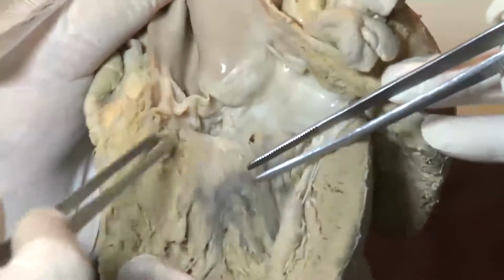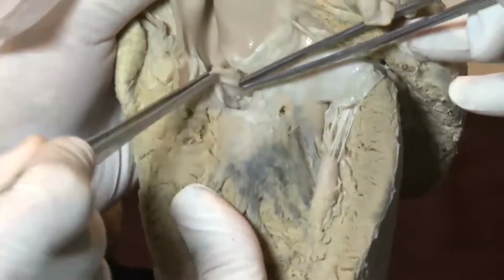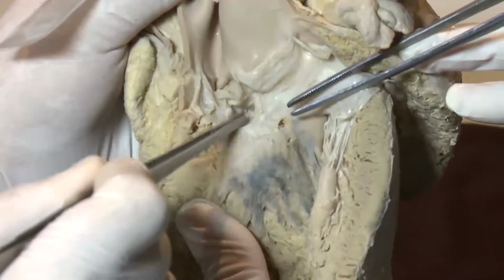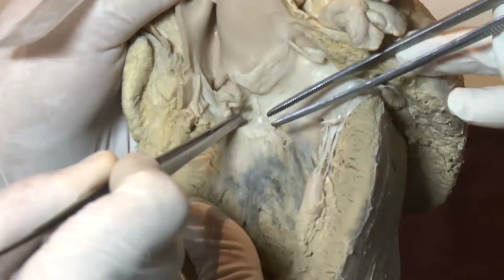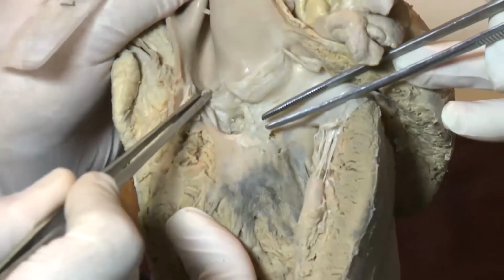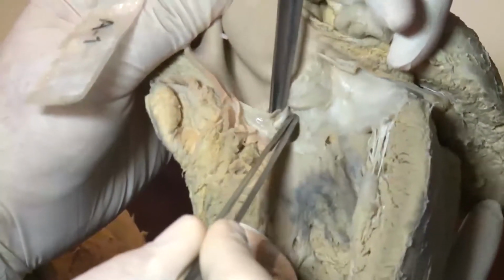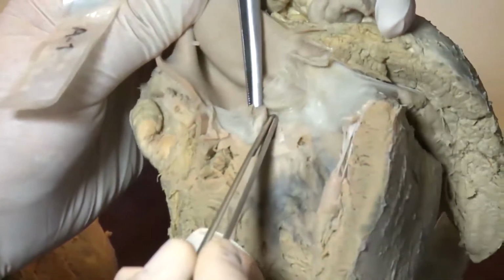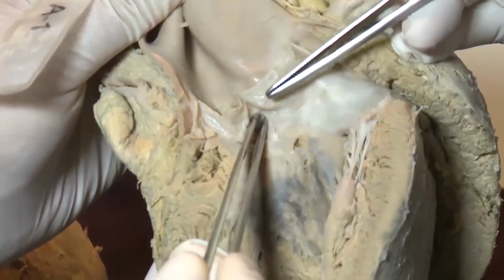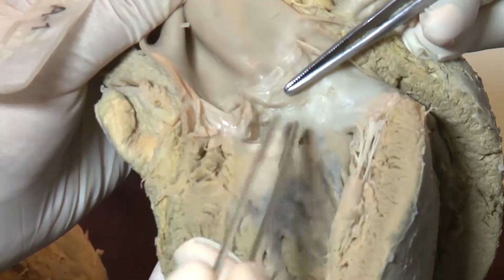This is a case of perimembranous VSD with aneurysm. Here are the right coronary cusp and non-coronary cusp, and there is a perimembranous septum. There is a hole, but it spontaneously closed before. But as you can see, between these two cusps there is some space. So if we use any kind of device, it may not touch the cusp directly.